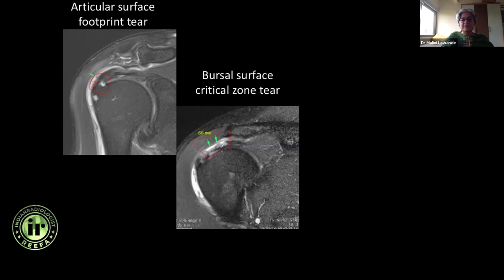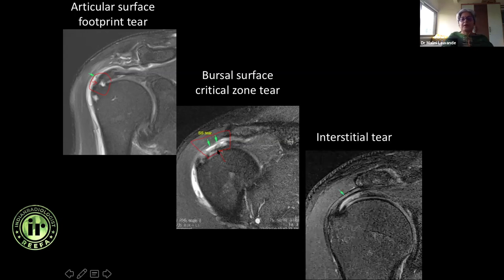As against that, here is a tear where the articular surface fibers are intact but the bursal surface fibers are torn. This looks like more than 75 percent thickness — I would say more than 75 percent thickness critical zone bursal surface tear. So that's what is important.